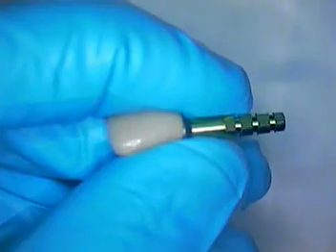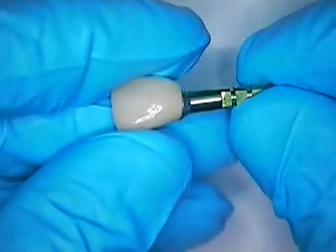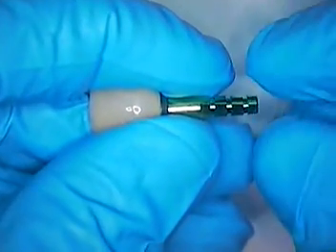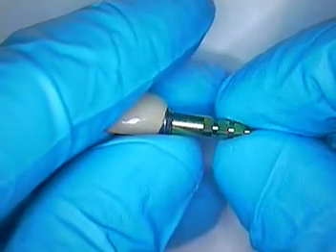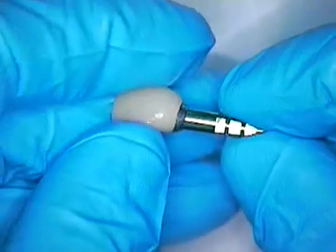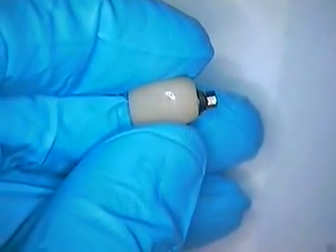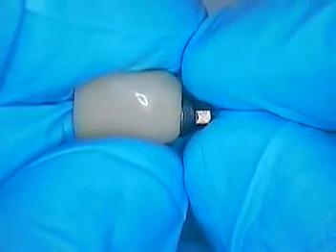This is an implant rescue case that was referred to me — actually a patient from the internet who looked at one of my videos and discovered that we have some good success with cases. This is the actual crown that came out of his mouth, and he presented it yesterday for me to try to solve.